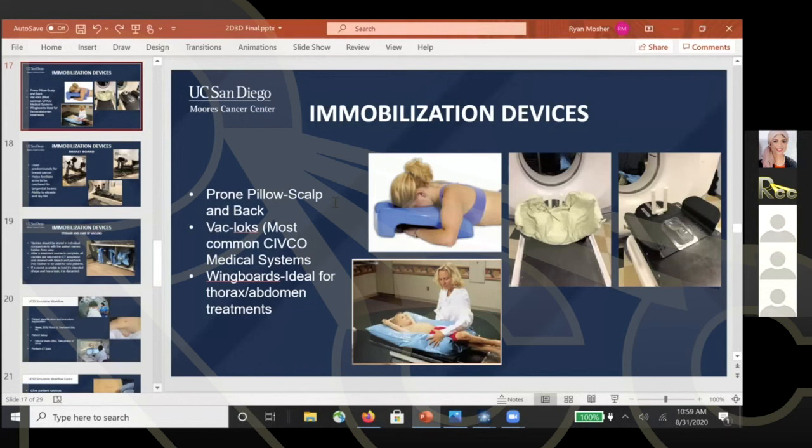They ask many questions regarding the fixation tool for TBI. There is no fixation for TBI. It depends, because I used to practice the total body radiation. It's plenty of ways, like low dose or moving table, fixing table. So yes, you're correct. Many types, yeah.